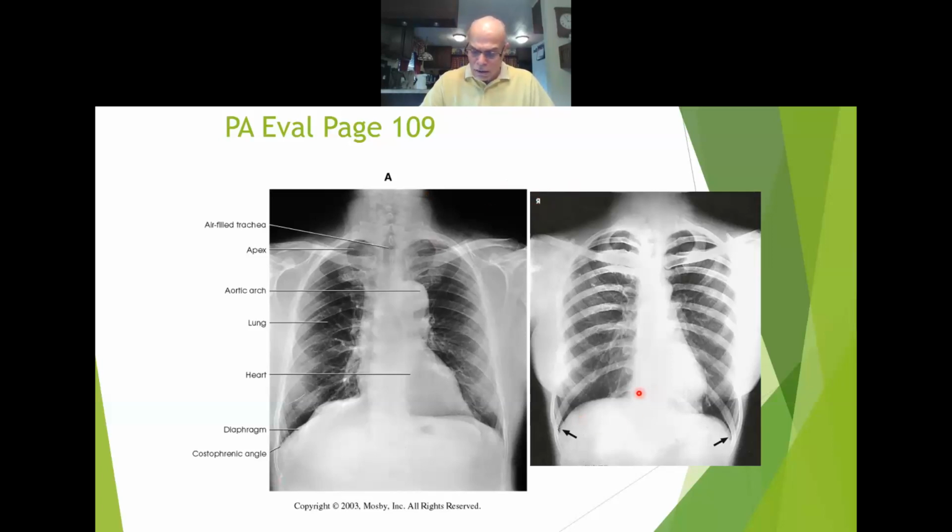Okay. Entire lungs with the apices to the costophrenic angles. Here's your apical areas here. They're fine. Costophrenic angles are clean. They're fine. They're demonstrated. No rotation. Remember, we looked at the sternal rotation, and I think that it shows really well here. You can see these little dots right here called your pedicles of the spine. You have equidistance right there to right there. So this looks really good. This does not look rotated at all.